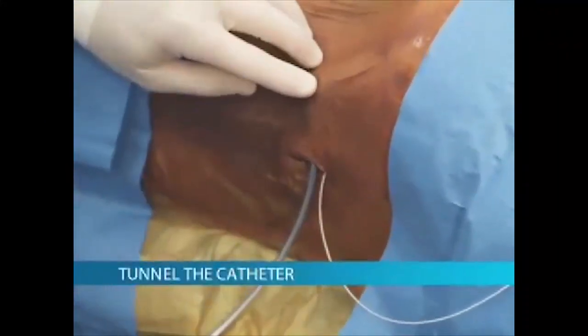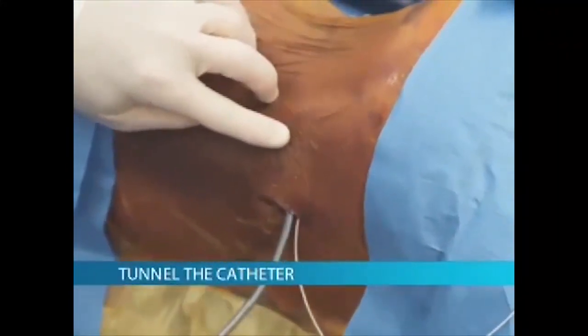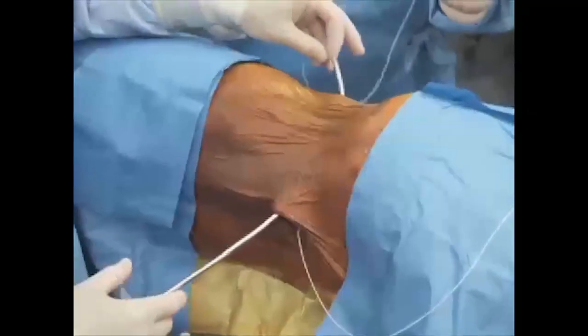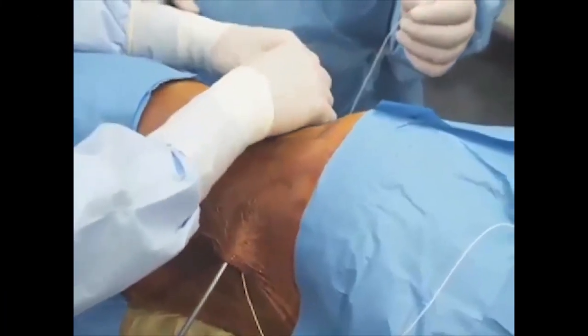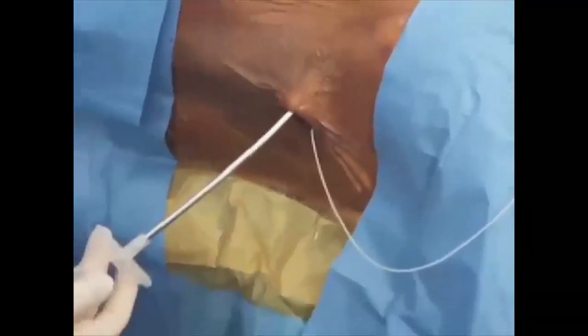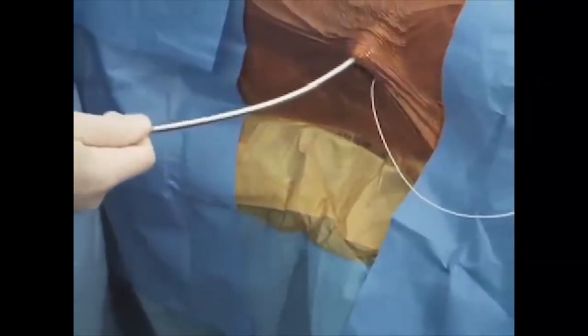Tunnel subcutaneously from the spinal incision to the pump implant site using the Medtronic catheter passer. Pass the pump catheter segment from the pump pocket to the spinal incision. Note, depending on the catheter model being used, you may tunnel the catheter in the opposite direction.